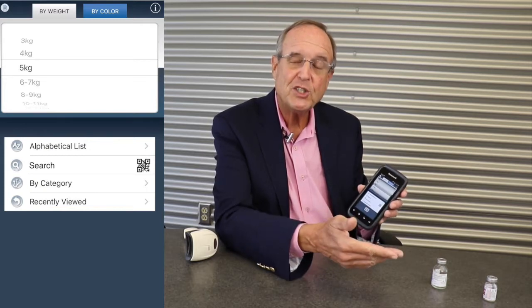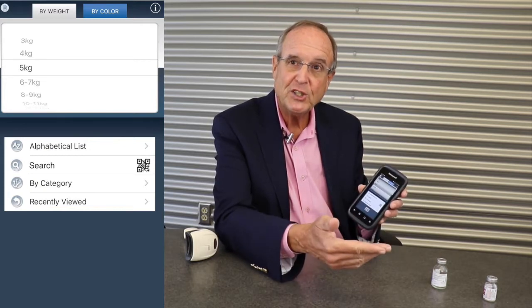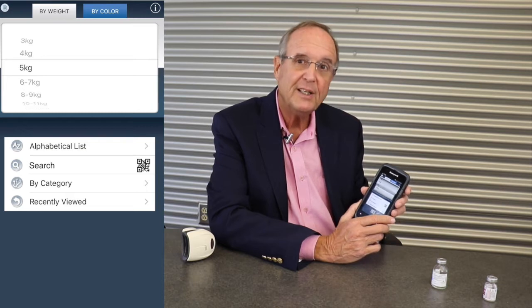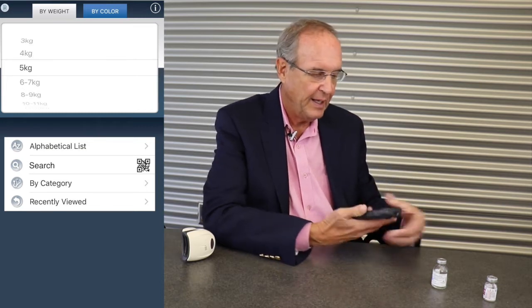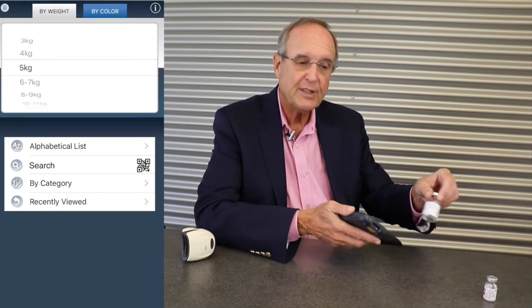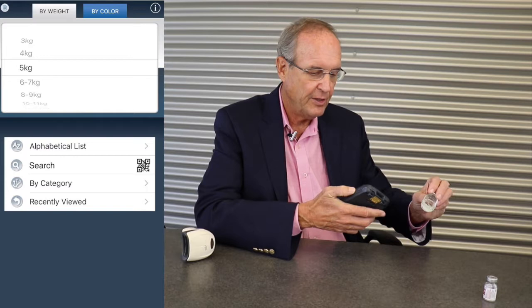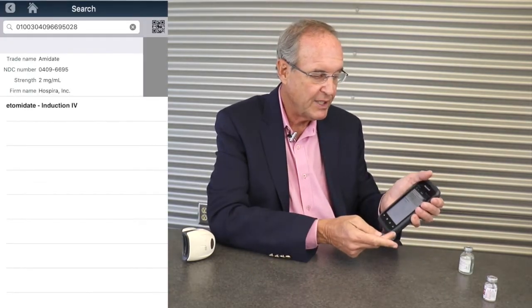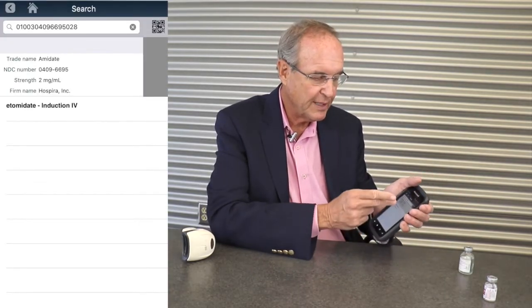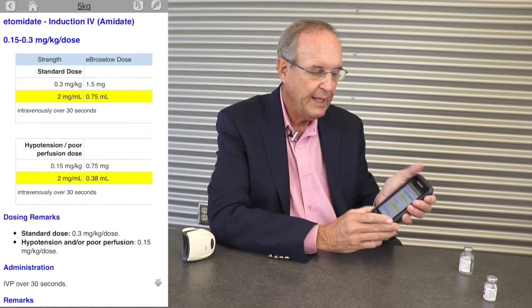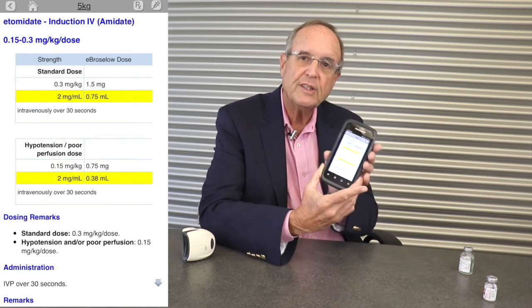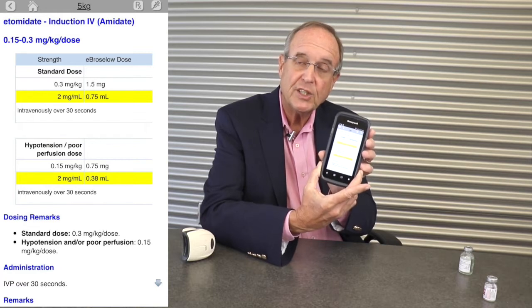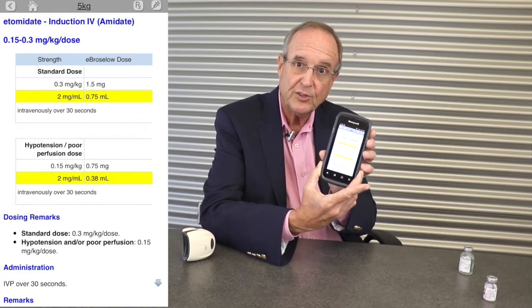My hypothetical patient needs intubation and I've decided to use Etomidate as my sedative. I simply pick up the vial of Etomidate, scan the barcode, select the indication — which is Etomidate induction — and I've selected the dose in milliliters for that indication, the standard dose.